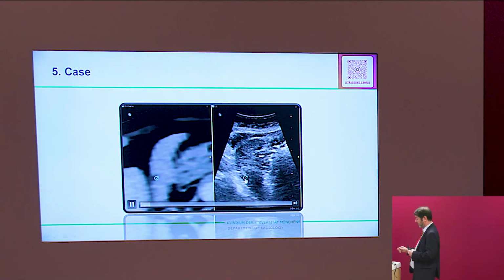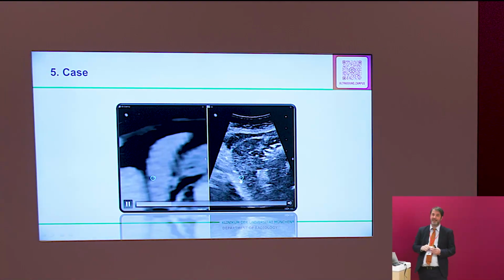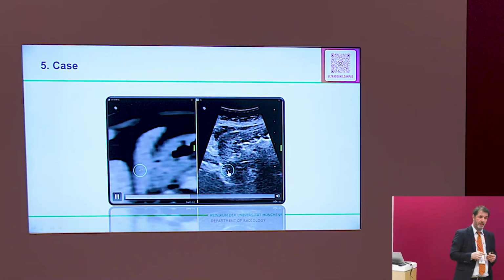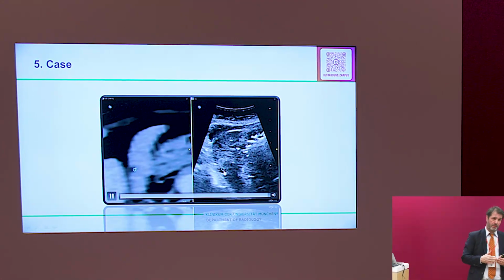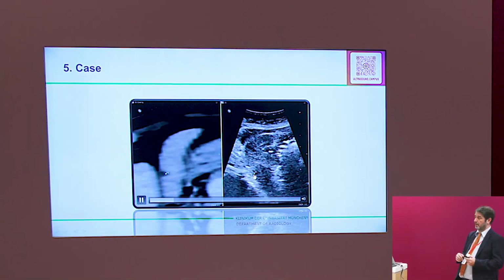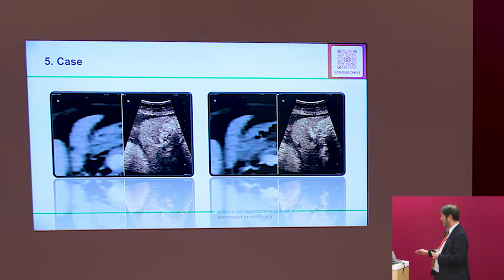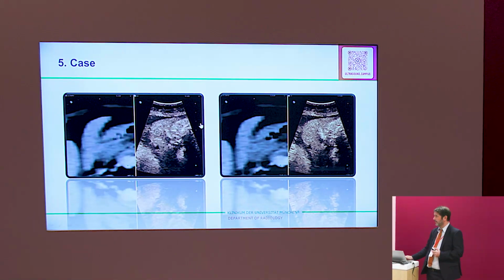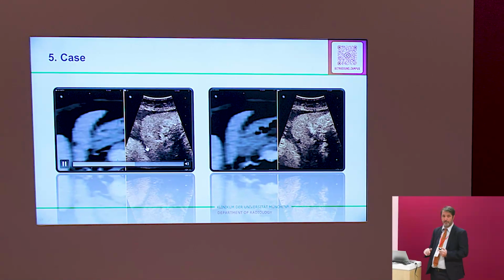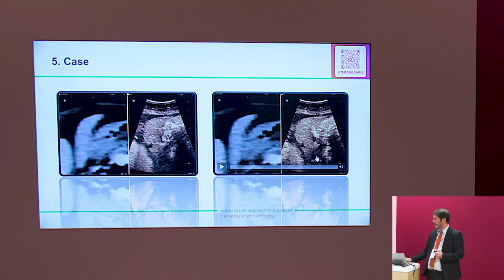Yeah, on the right, here, where the blue circle is, where the mouse cursor is. It's black in the midfield. Black, that's very good. Black means most of the time liquid in ultrasound. So, high suspicion of a cystic lesion. So, we inject contrast. What is here? Is it still black? Yes. It's still black also here?